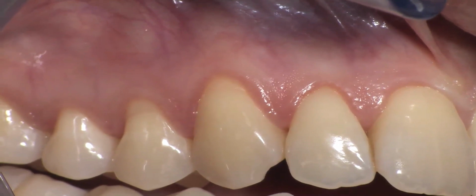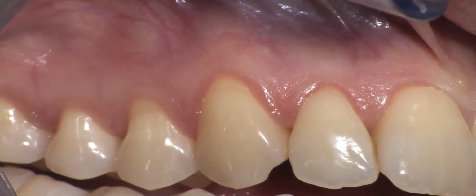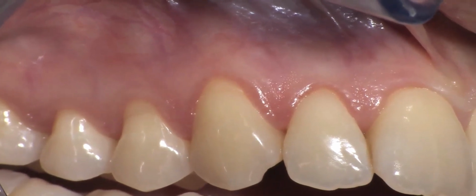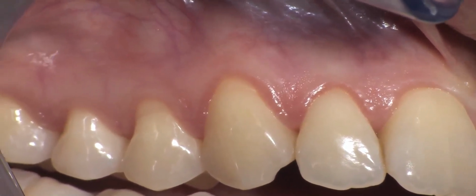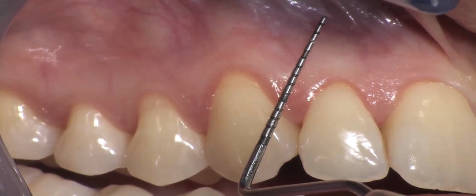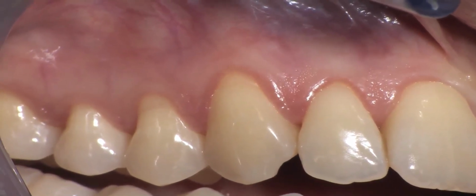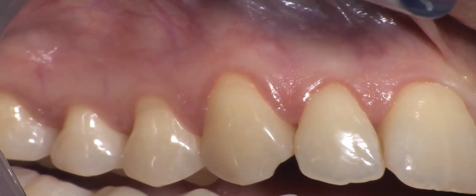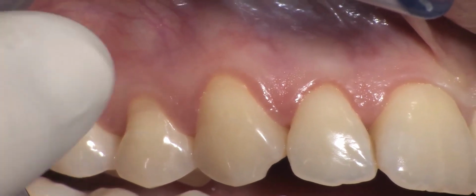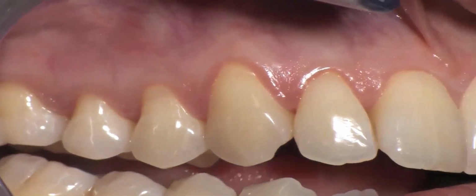So I want to show you the surgical technique for treatment of gingival recessions, but with a vertical releasing incision that, different from what I explained to you yesterday, will be triangular in shape, in order to see the advantage of the triangular incision with respect to the trapezoidal. Even if I already told you yesterday, you should always start with the trapezoidal because it is less dangerous, and you can also make some small mistake, and this is not such a big problem.